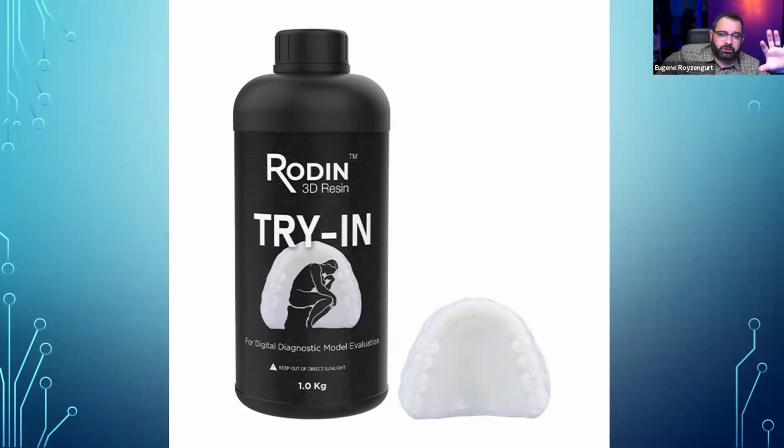And I'll be showing you some other things for fixed here, not for hybrids here, where I actually print stuff that I need to adjust. And if you have a really brittle resin, it's really difficult to adjust. This resin is not brittle. It's more of a kind of almost rubbery a little bit. So it makes it really easy to grind. It doesn't clog your burrs. That rubberization is not that much, but it's enough not to chip big chunks away from your try-in, okay?